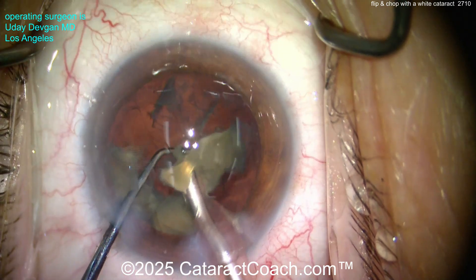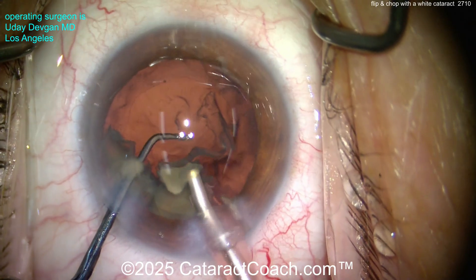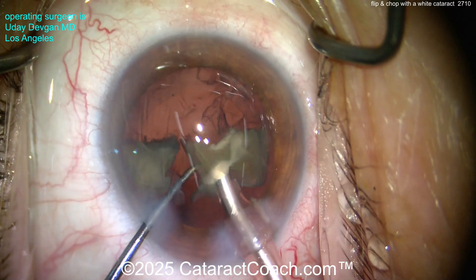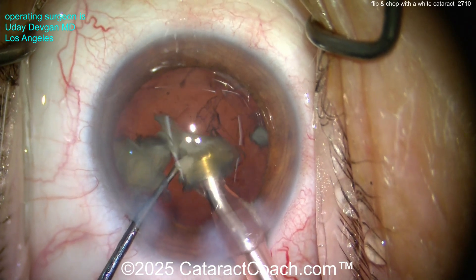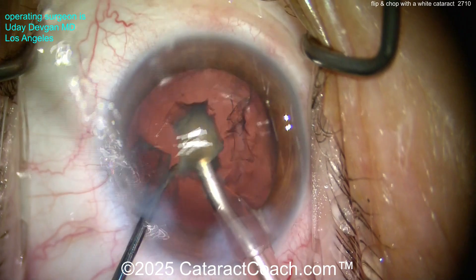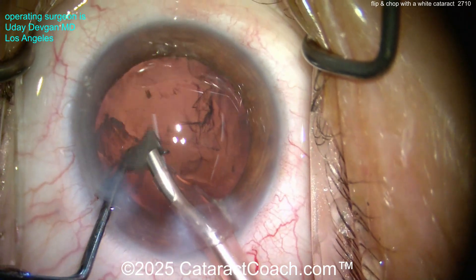Remember, not a whole lot of cortex remains in these eyes. Once we get the last couple of nuclear pieces, nothing is really weighing down the capsular bag, so I don't want the posterior capsule to come forward. As we remove these pieces, we'll keep that soft chopper in the safe position — meaning the blunt, smooth back end of the chopper is toward the capsule, so that if the capsule comes forward it doesn't hit the phaco tip.